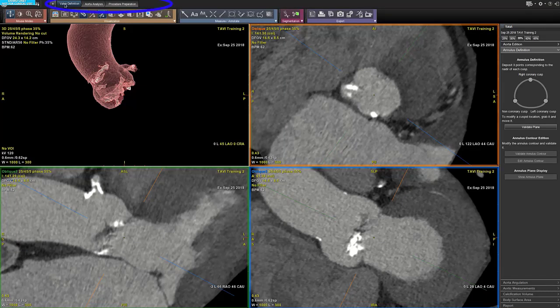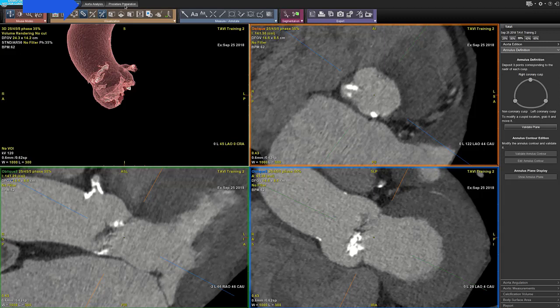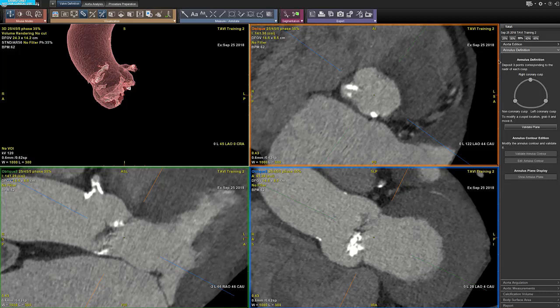There are three main steps in the TAVI software: valve definition for device sizing, aorta analysis for the vascular access definition, and procedure preparation to send some segmentation to a vision application for the interventional part.